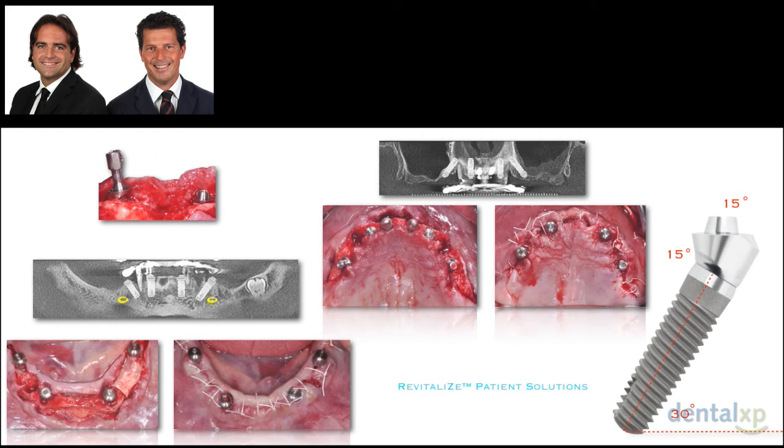You can see the x-rays, in which you can see our treatment plan. You can see the implants in place, you can see the sutures, and with our protocol the patient stays like this for 24 hours, because we want to give our lab technician the correct time to build a provisional.